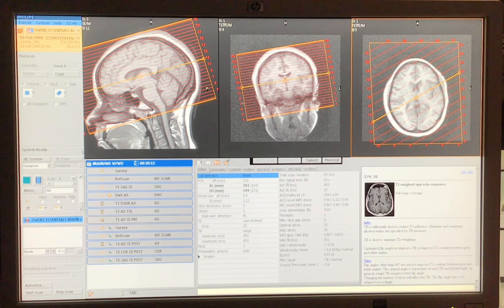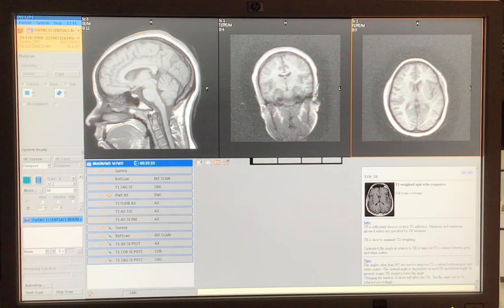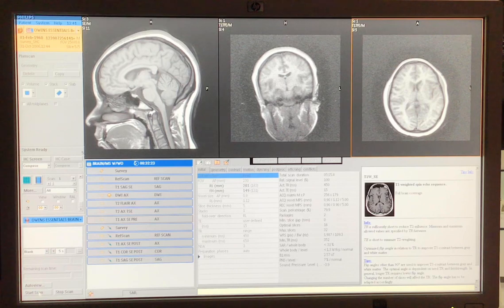And if you ever want to be talking to your patient, this is telling you how long it's going to take. 5 minutes and 25 seconds. So I can proceed and say, okay, Mary Jo, this next set's going to take about 5 minutes and 25 seconds. You doing okay? Yes, and you're good to go. You're going to start it. Because this is a with and without contrast, for number 4, all you have to do is say, okay, Mary Jo, I'm going to go ahead and give you that contrast right now.